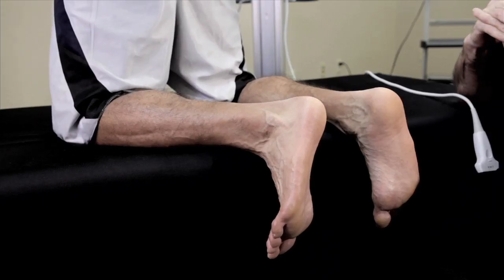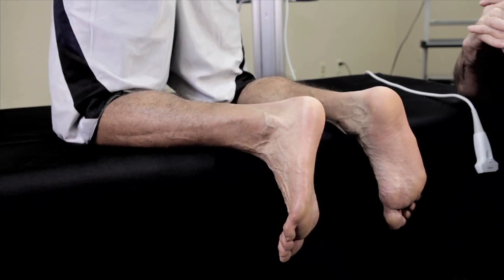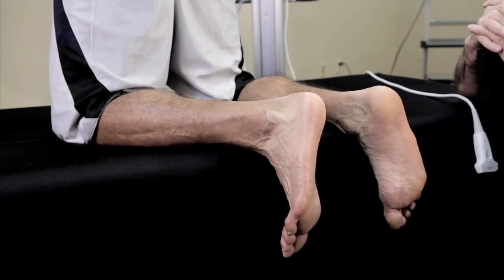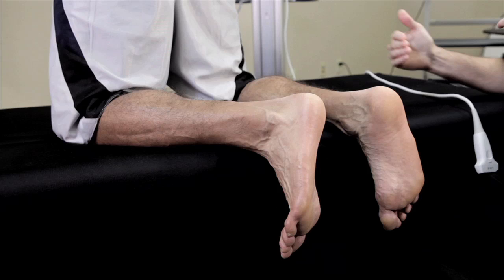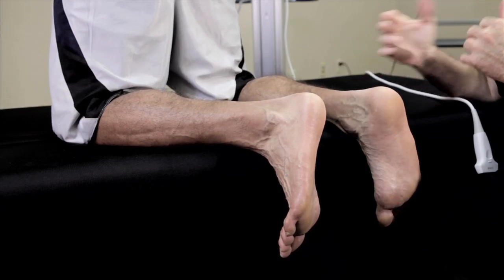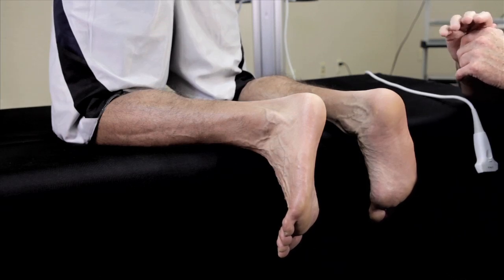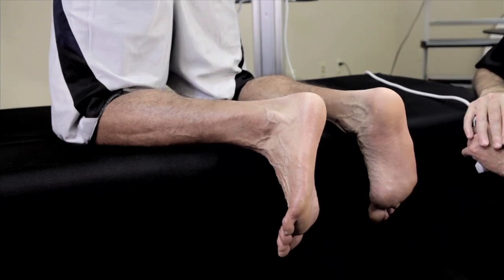Another very common image in the foot and ankle protocol is to visualize the plantar fascia for patients with heel pain. Typically, the patient would be positioned prone on the table with their feet hanging off the edge of the table. You can also alter that by asking the patient to kneel into a chair with arms on it to stabilize themselves.